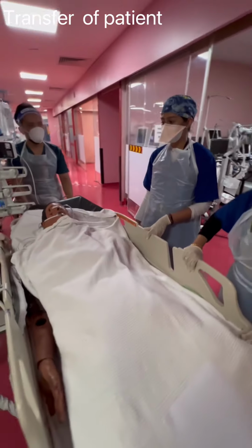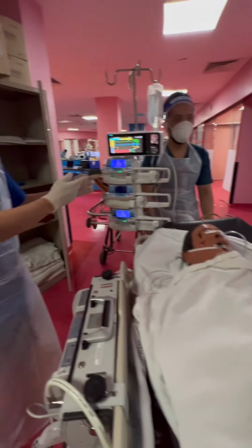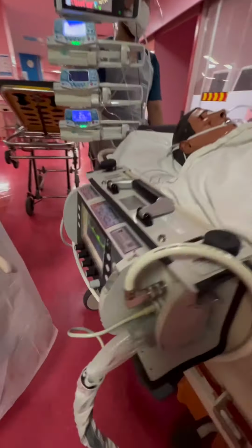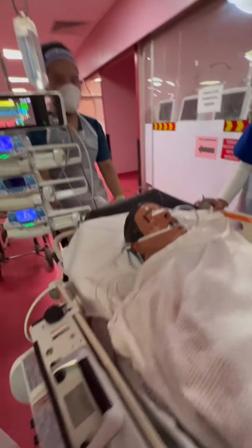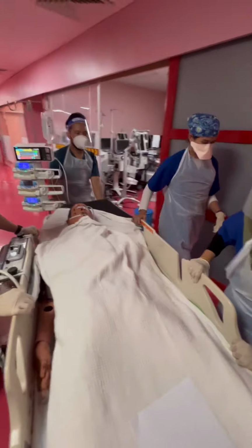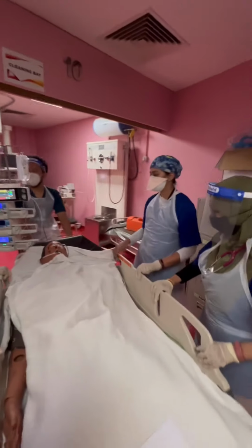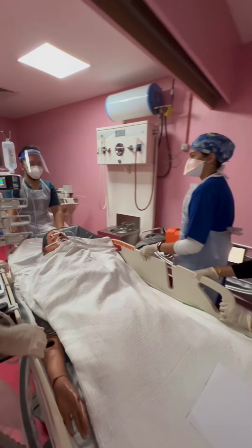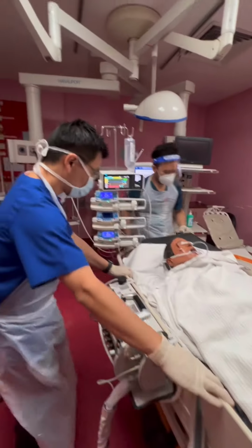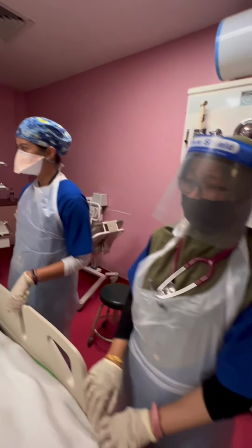Throughout the transfer, ensure that the treating doctor is monitoring the patient's vital signs as well as the ventilator waveform and alarms. And once we have arrived in our ward or ICU, we would transfer the patient and pass over to the treating doctor of the receiving team.